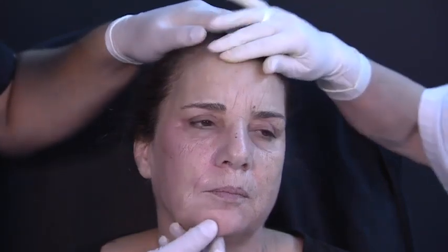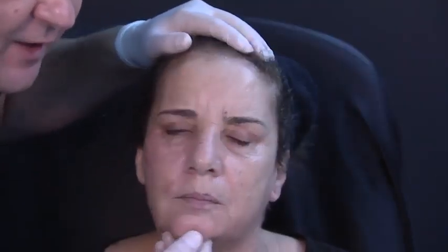Right, no, we're going to talk about everything, guys. I'm here to talk about everything. We 3 are here. Look at the final result. Look at the camera. Yes, that's okay. Good. This is a quite nice result for 2.5 ml in total, okay? Do I still can improve here or here? Of course I can. Look at the camera. But look at this side, okay?